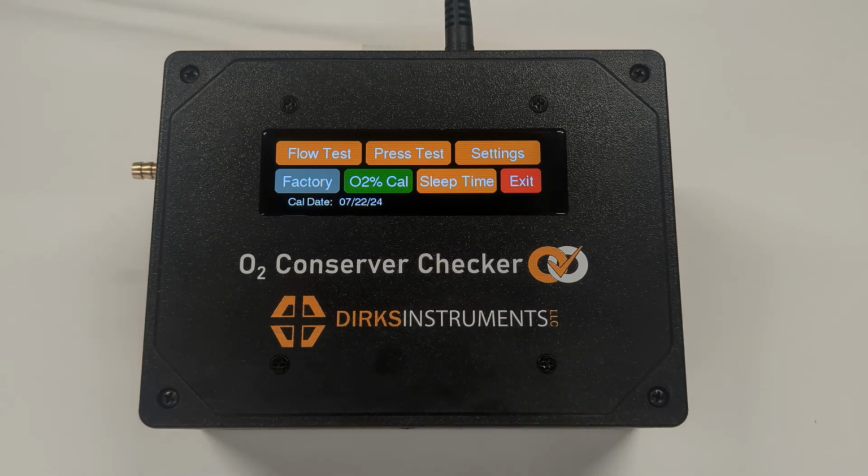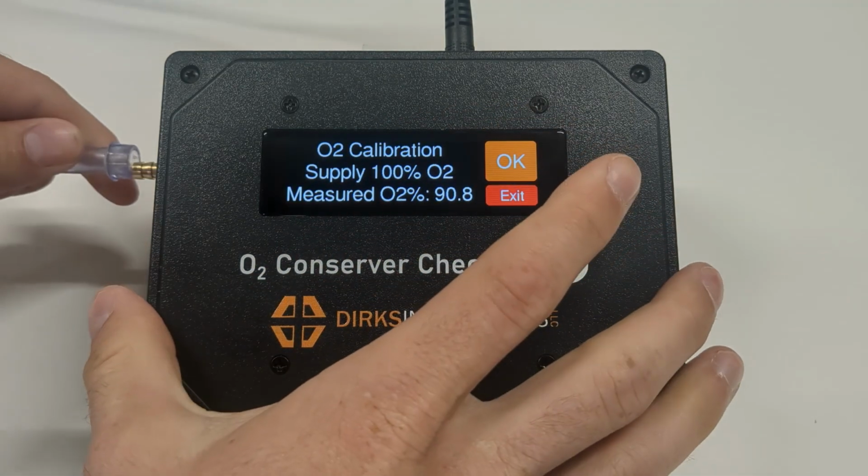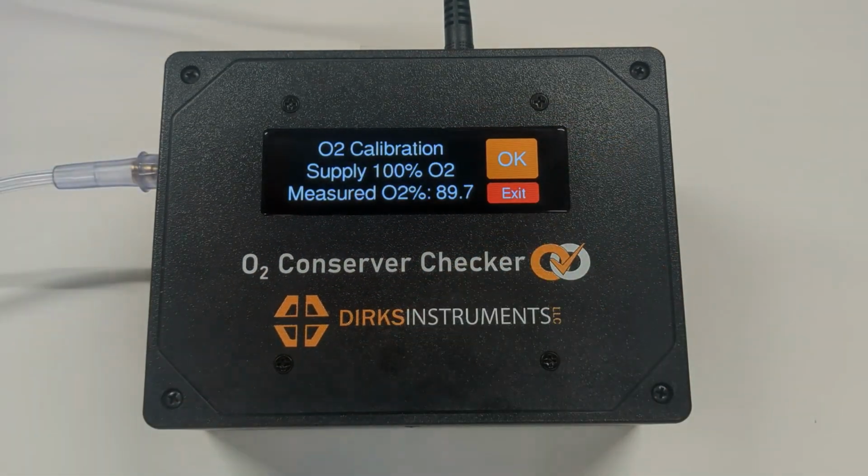The O2 Cal button takes you to a menu where you can recalibrate the oxygen sensor using 100% oxygen. Once you go to this menu, you can supply oxygen between 1 and 2 liters per minute to the inlet port. The measured value will be somewhere between 85 to 92%. This is expected. This is just the raw value that we typically see with 100% oxygen.